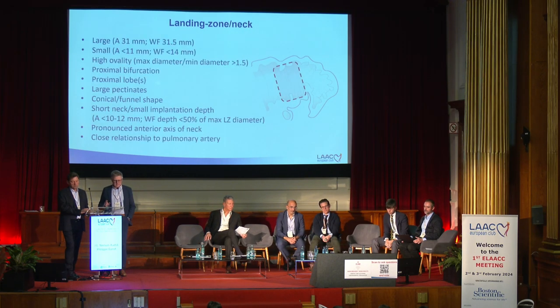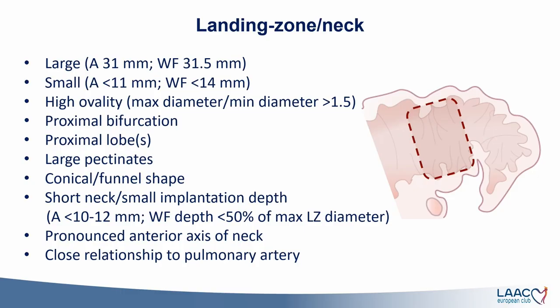So next anatomical region will be what we call the landing zone. And again, as already said by Sergio, this is device specific. If you have a very large landing zone, you can get difficulties with some of the devices, as they cannot cover the full landing zone diameter. In the same way, if you have very small appendages, we might have devices that can create some damage. So a very large and a very small landing zone area can be a problem.